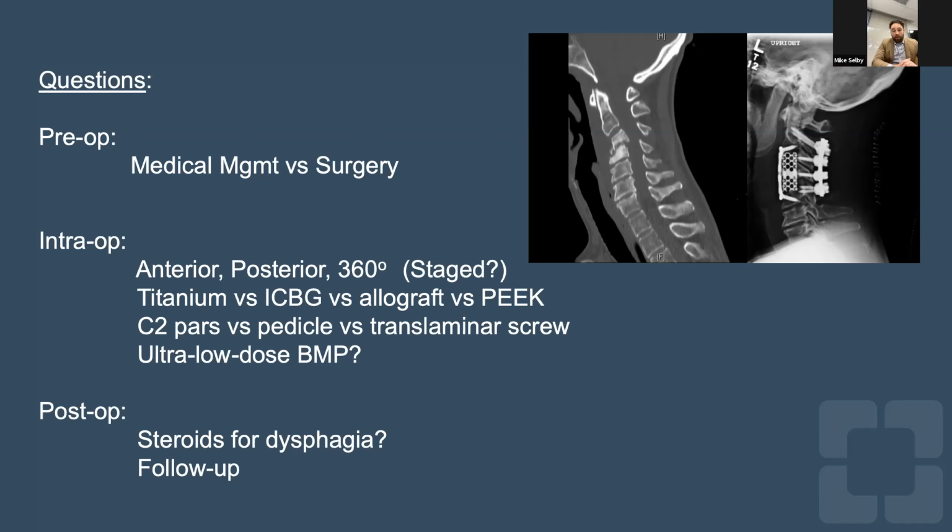Jonathan, I like your construct here. I think it's really good. And yeah, the C2 pedicle screw, if you use navigation, is just a walk in the park for these. Most patients you can navigate a C2 pedicle screw into. I used to be a lot more anxious doing them freehand, but now it's pretty straightforward.